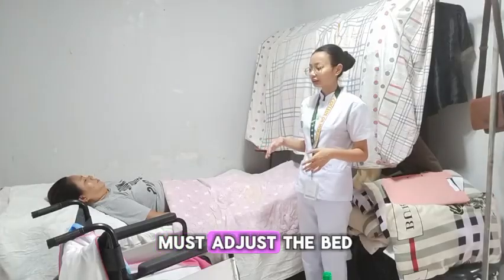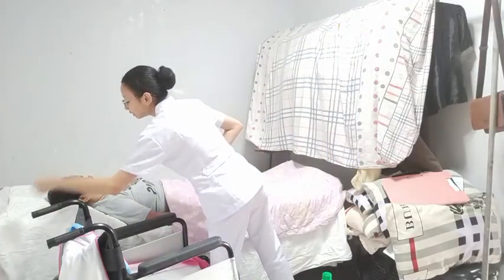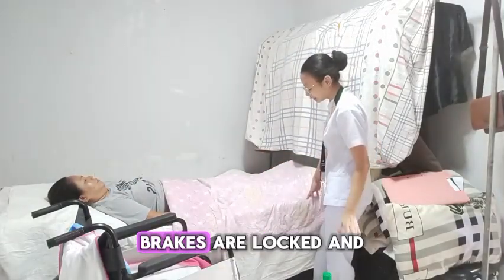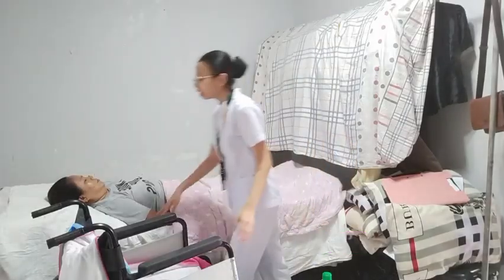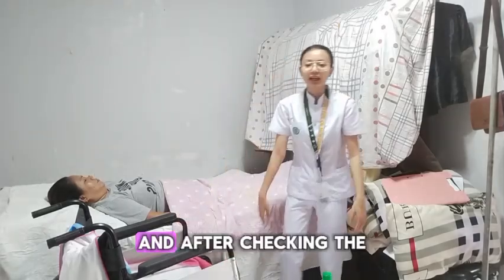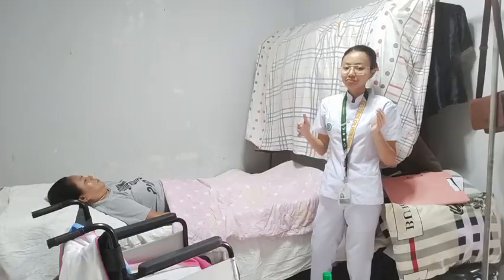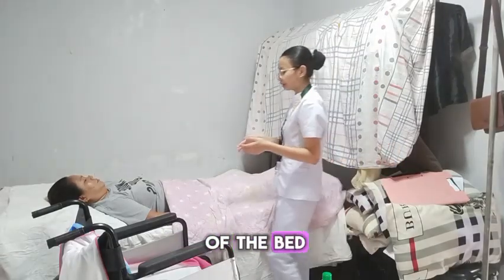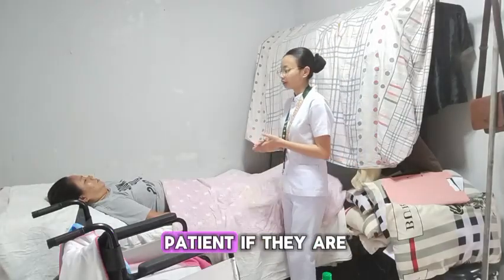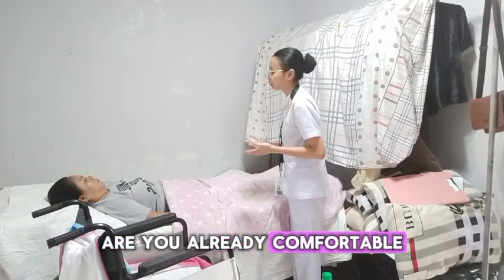And after that, we must adjust the bed to the lowest position. And make sure the brakes of the bed and the wheelchair are locked. After checking the brakes of the wheelchair and the bed, we must lower the side rail of the bed. After lowering the side rail, we must ask the patient if they are already comfortable to move. Ma'am, are you already comfortable to move?